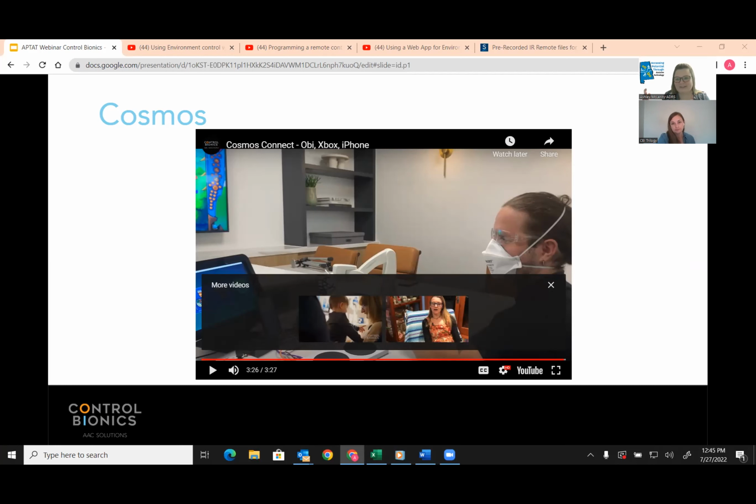Yeah, so basically, if your device doesn't work in the way that we're showing you other options today to connect it to the GridPad Trilogy or the NeuroNode Trilogy, if there's not a way to automatically connect it, then you could do the Cosmos add-on. And you can hardwire, like I said, 8 devices or connect 1 device via Bluetooth. And the eight is going to be like your switch output. With the NeuroNode, normally it just sends out 1 HID code. So this then gives you 8 outputs versus just the 1 single.